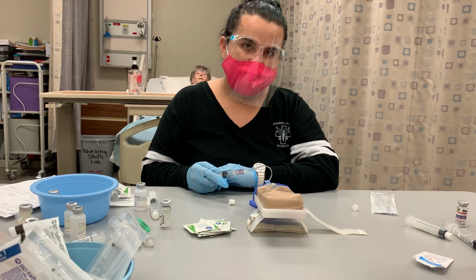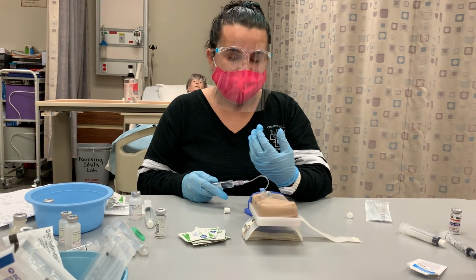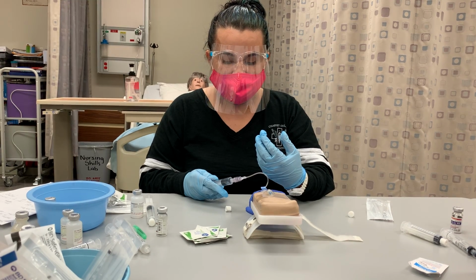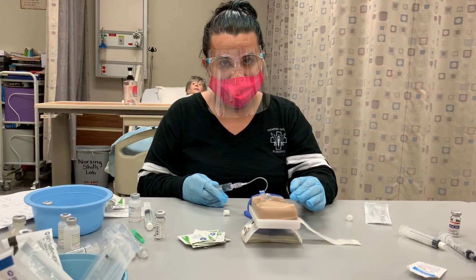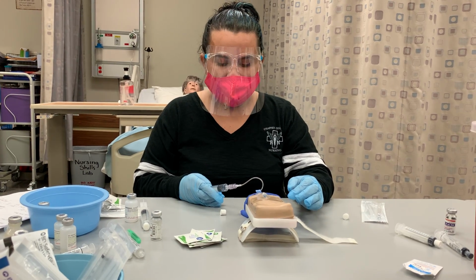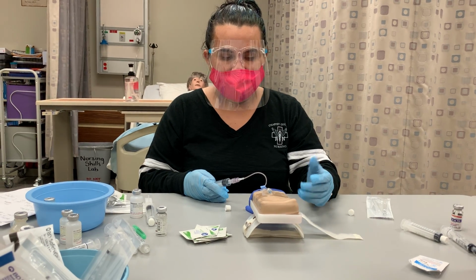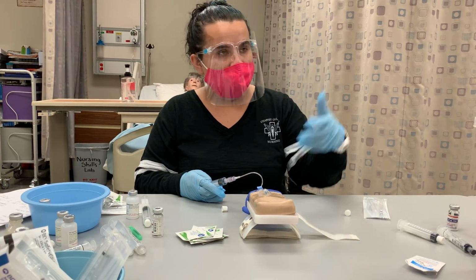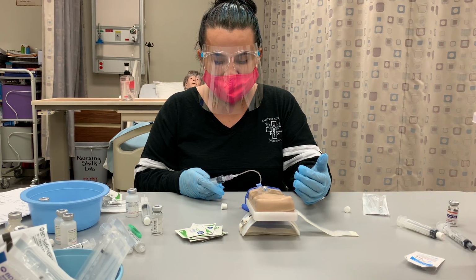So for instruction purposes only, I would make sure that I push the medication nice and slow, very flowy, for 4 minutes. For 4 minutes, while I'm pushing my medication slowly, I want to be assessing my patient, making sure that he or she is not having any adverse effect, any reaction that we don't want.